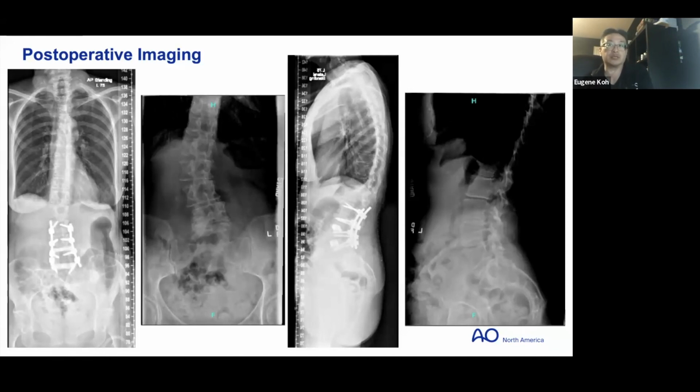When I'm in a lateral decubitus position, I have the resistance of the whole table that I'm putting the cage against. I've noticed that when I've done these in the prone lateral, I'm using a lot more force putting a cage in. So I'm not sure about doing a bilateral approach just to save time. I think for me right now, I'm still getting the logistics of it to work out perfectly. I just do it on one side. I'm not fancy enough to do it bilaterally.